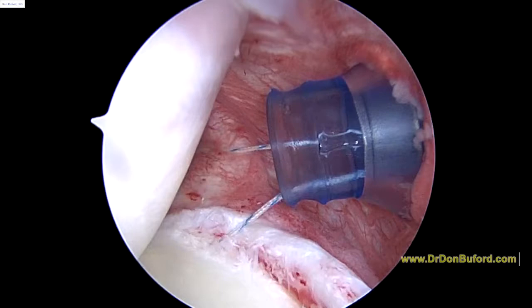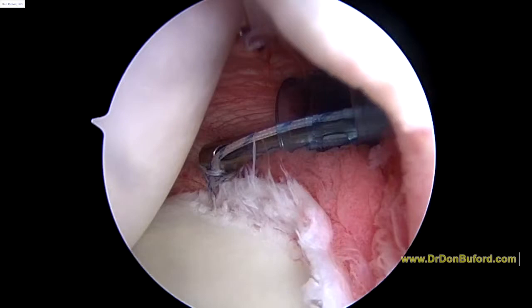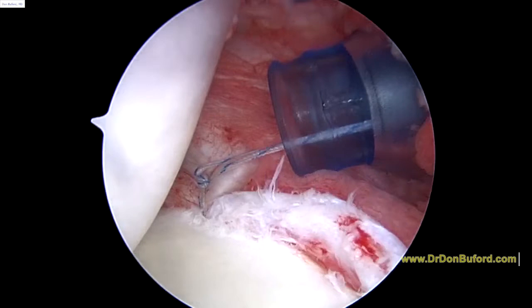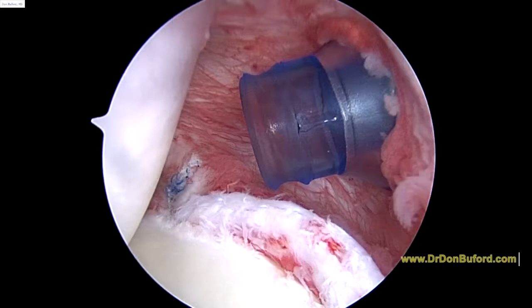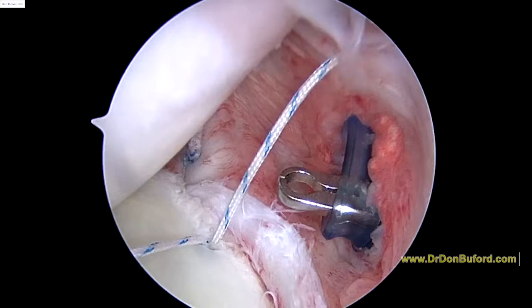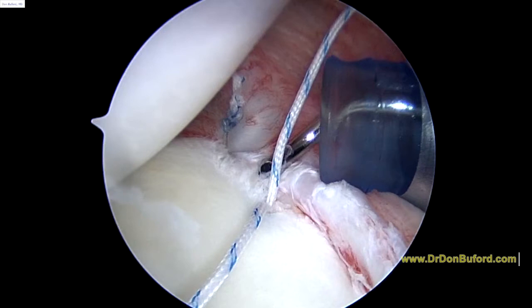And now we have a nice loop to tie to reconstruct this problem here. So now as we pull our knot down into position — watch on the capsule — now that's going to bring that down. So that's the first knot. We're going to do the same thing another time, maybe even two more times. We've got our second anchor down — you can see the position here. We're now going to take our suture passer and grasper and make another stitch.